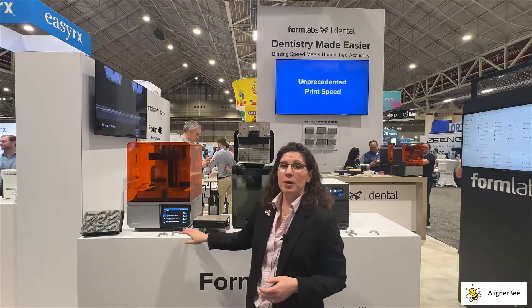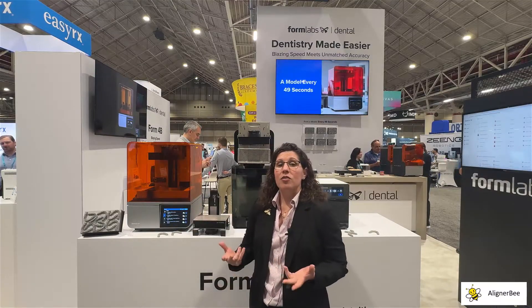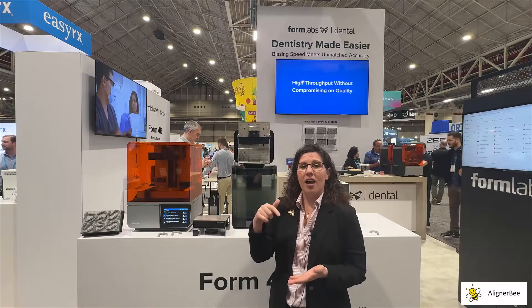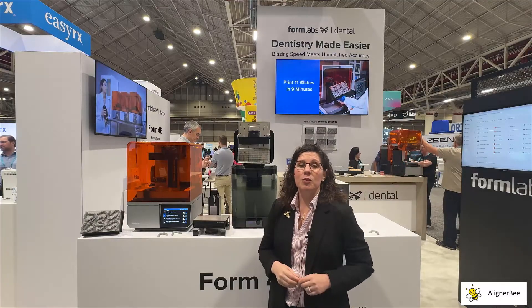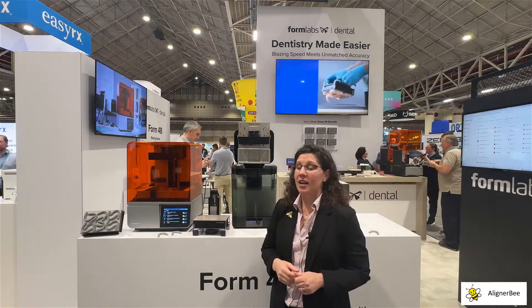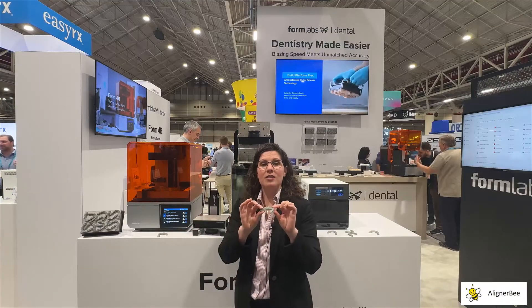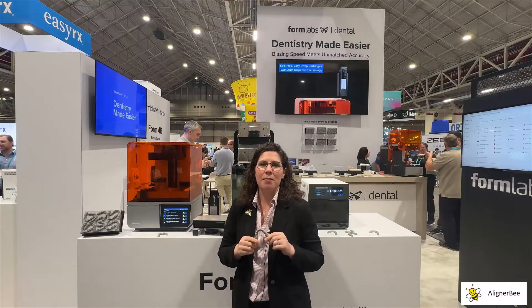With the new Form 4B printer there has been a change to the optic system. The traditional SLA that most of us visualize — the laser tracing the model on the build platform — created very smooth models, however it had a slower print time. Now with the new mask SLA technology, orthodontic models printed horizontally can be printed in approximately eight minutes.